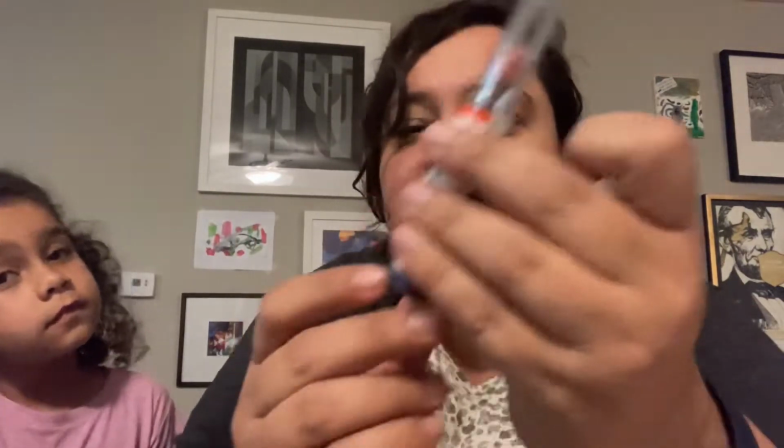Can I say something? People may be wondering what types of injections those are. So can you explain it to them? Yes, there's intravenous, which goes into the vein. There's intramuscular, which goes into the muscle. And there's subcutaneous, which goes basically right under the skin. And that's the type of injection we're going to do with this tiny little needle.